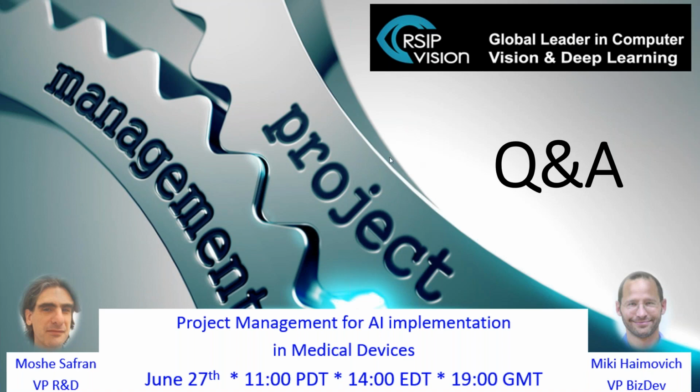Another example is we currently have a very big ongoing project for surgical navigation. There again, some of the modules are deep learning, some of them are 3D registration, etc. The research is usually done in Python, but the modules that we're delivering to the customer are all written in C++, and they talk to the customer's software GUI that's on top of that, in order to run efficiently and more robustly.